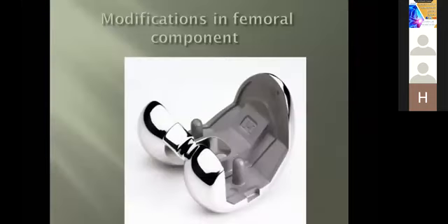It is designed simply to improve the range, to give the patient a choice to make use of his flexion, not to do this 5 times per day, every day, so that whatever polyethylene you put there will be worn out and you have an early revision. There are some modifications in the femoral component that allow this degree of flexion.